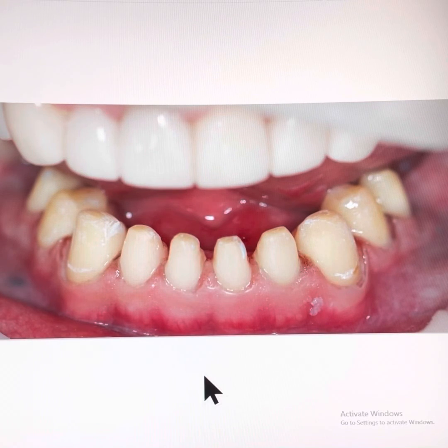I guided the lower jaw into a better position, minimizing the forwards and upwards motion, and the mandibular shift that had developed as a result of the many years of teeth grinding.